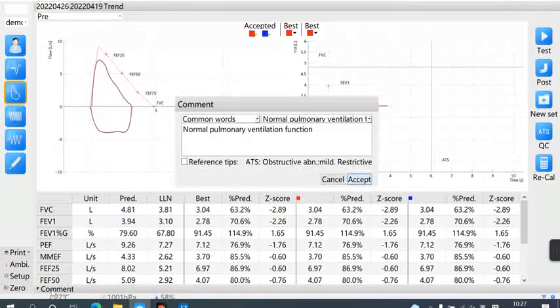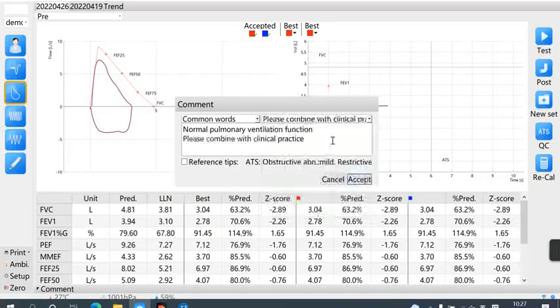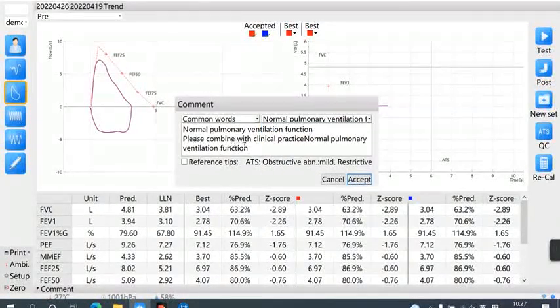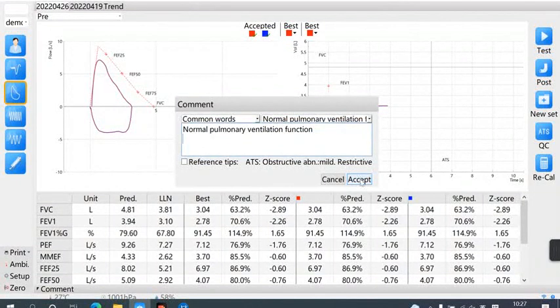Click the comment in the lower left corner to enter the results in the comment box, or check the checkbox before the reference prompt to use the results generated by the system. Or click the common words in the upper right corner, select the corresponding sentence, and add it to the comment box. Click OK to save.